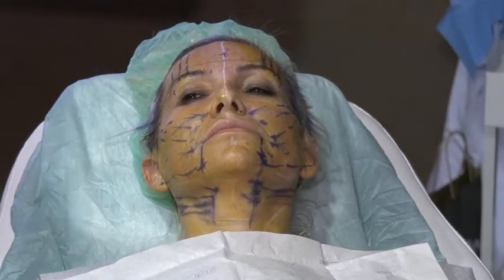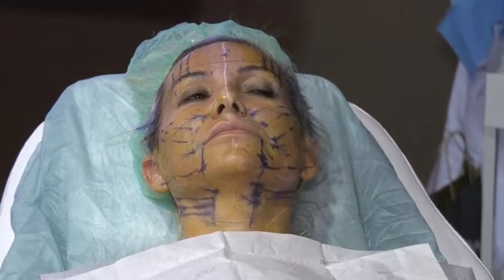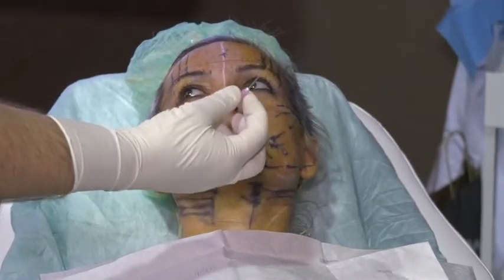The first thing we are using is the L-shaped cannula. So we have to do the entry point. I use the 18G to enter the entry point.